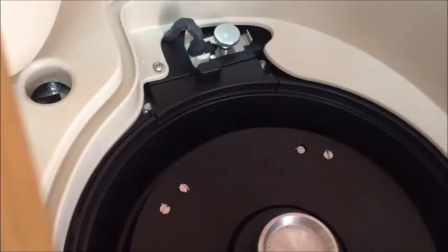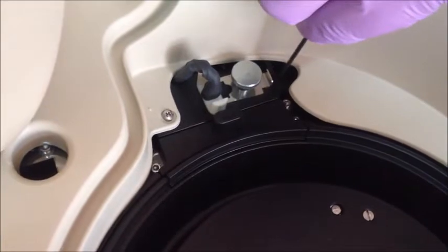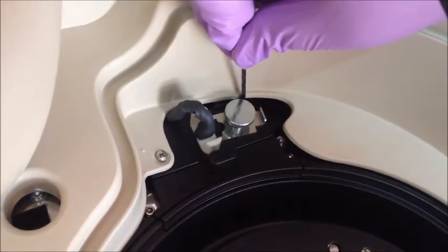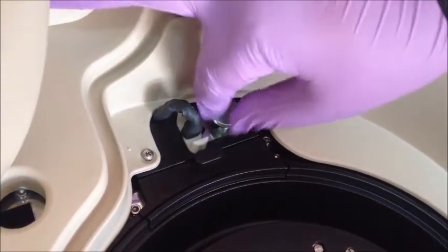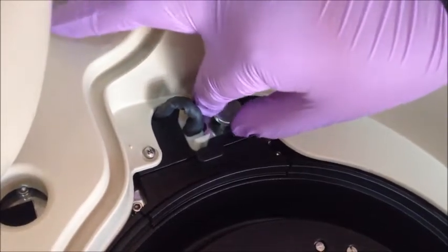Lock the metallic plate holder and tighten the thumb screw. Put back the rotor cover.